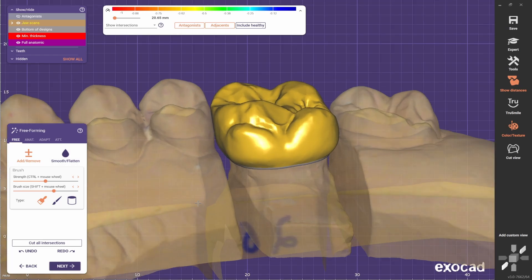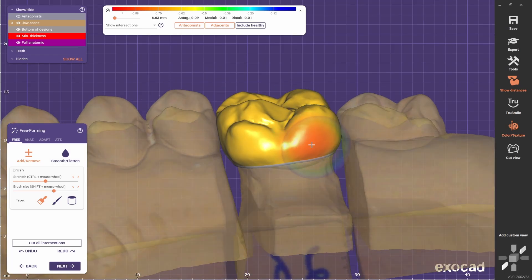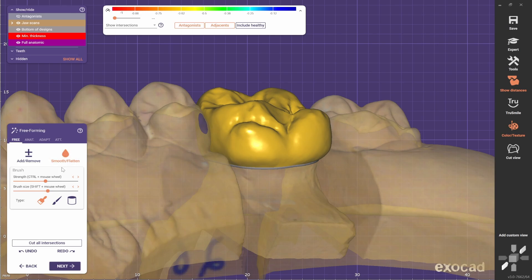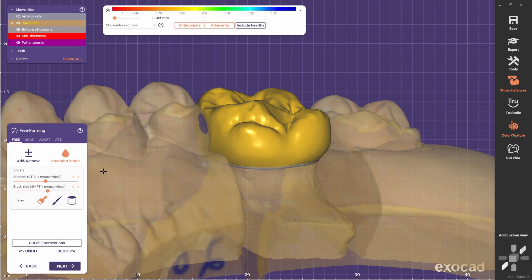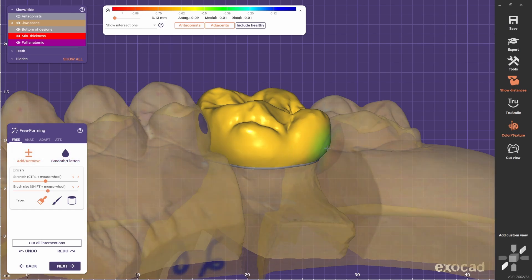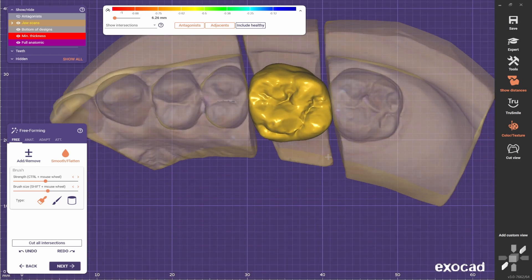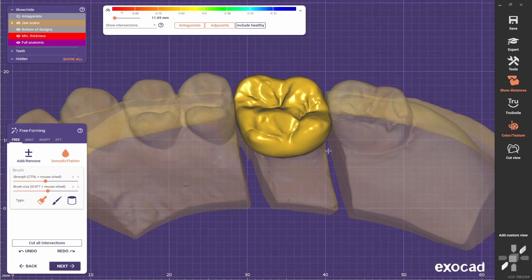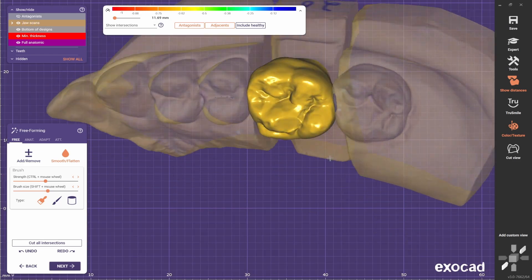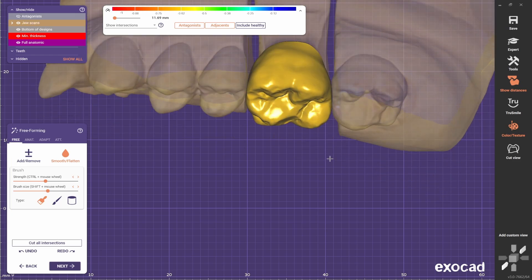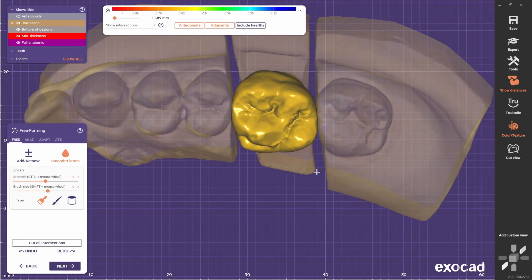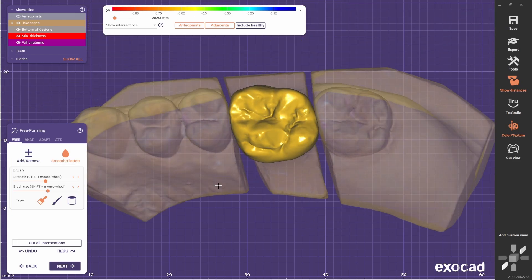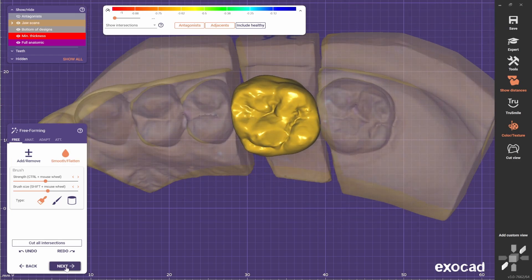You can use these tools to shape the teeth. You have the adapt tool to make it bigger and bulkier. You have the smooth tool which smooths out the surface. Also if you press shift, you can decrease volume. But today, to keep it simple, I'll just leave it as it is. I'm happy with the design, so I go next.